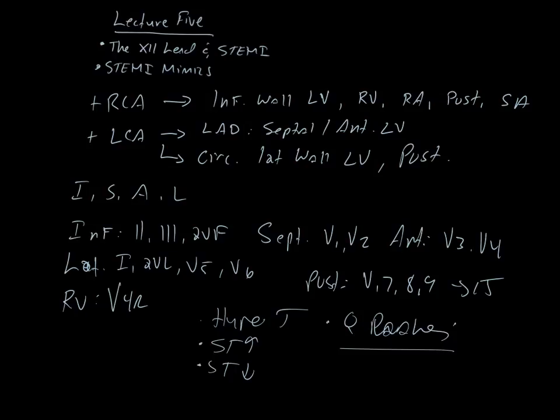All right. What is significant generally for ST elevation? Wait, when are the pathological Q waves? Days after? Yeah, hours to days. What are our thresholds? It's 1 millimeter in 2 or more contiguous leads, right? That means they have to be in the same lead group.